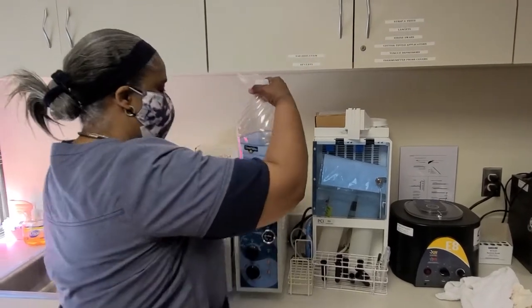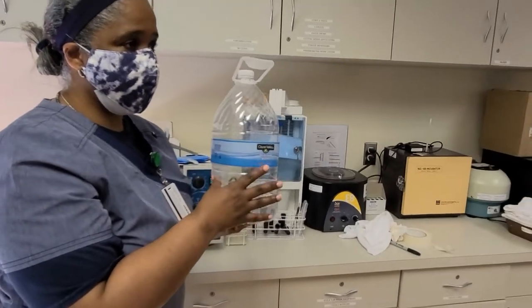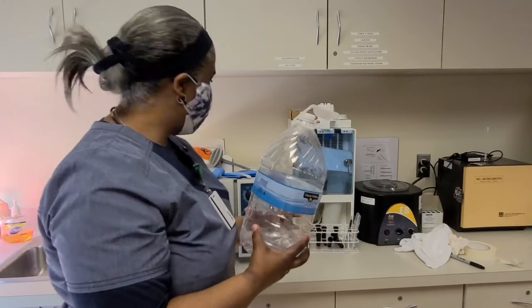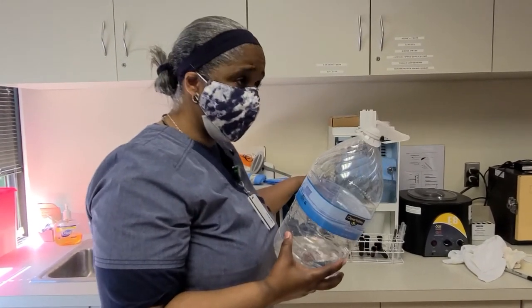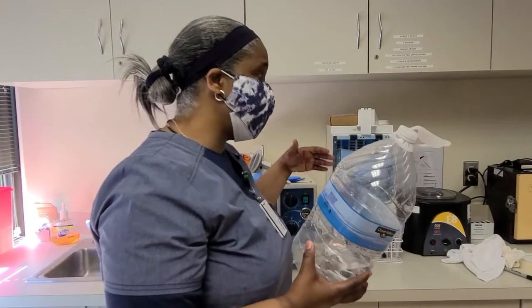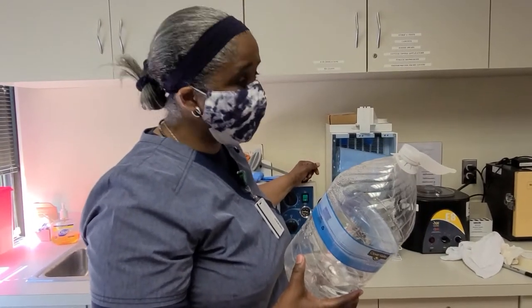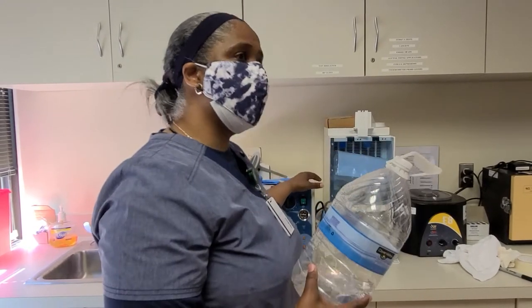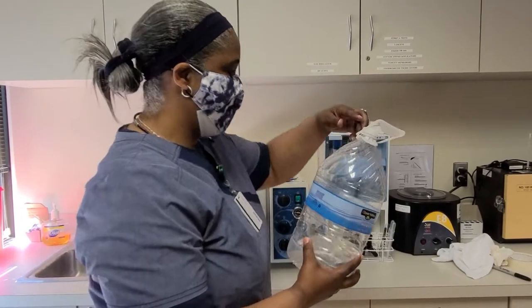So now I'm going to use distilled water. The reason why I use distilled, not spring, not tap, not purified, is because only distilled water works best with an autoclave. If you use any other type of water, it will cause corrosion and it'll make the parts not work and not autoclave properly. And it can be expensive having to fix this. And what they would have to do is give you a loaner autoclave until they fix it. So always, always, always use distilled water.